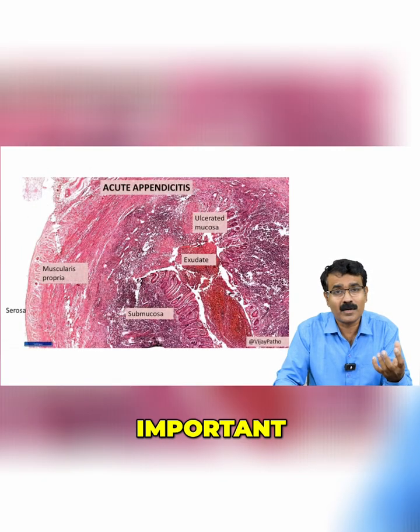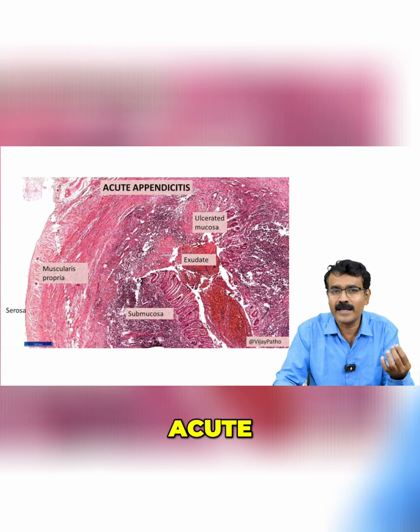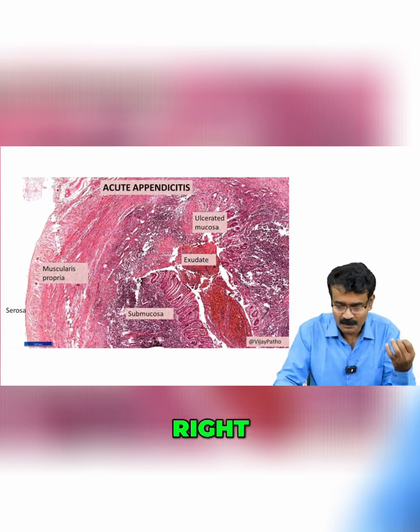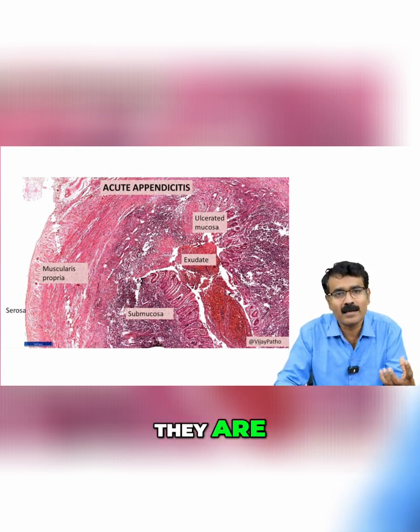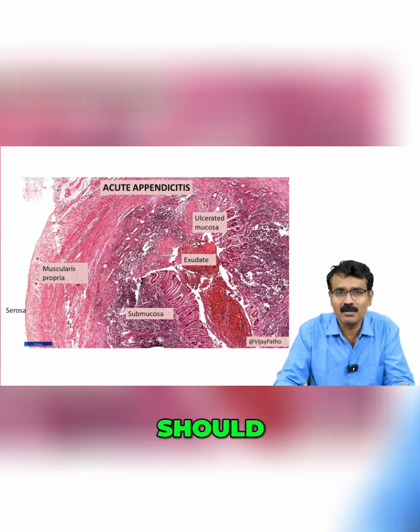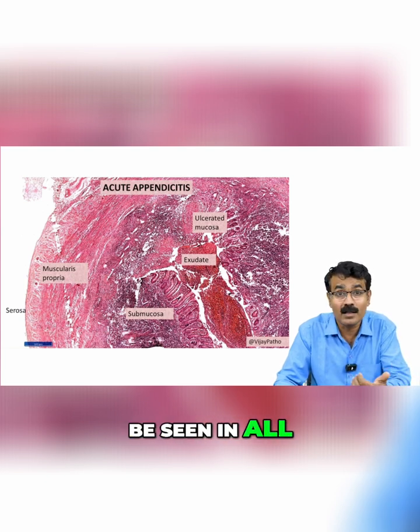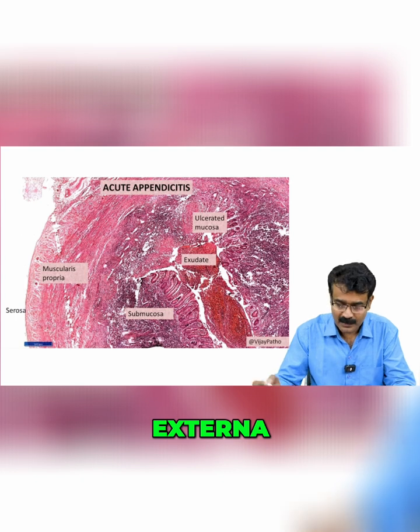The most important identification feature of appendicitis is to demonstrate the presence of acute inflammatory cells, because you are looking at acute appendicitis. What are those acute inflammatory cells? They are neutrophils, and these neutrophils should be seen in all the layers, particularly in the muscularis externa.